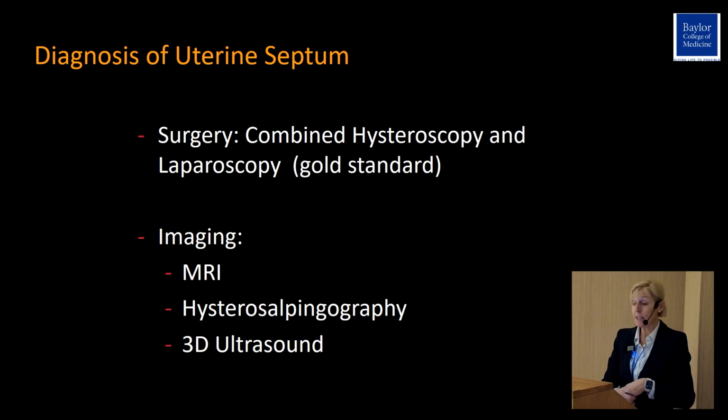For the uterine septum, though, despite all these dissenting ideas about what should be the length at which you should incise it, we know that the combined hysteroscopy and laparoscopy was the gold standard for diagnosing it, as you also saw Dr.